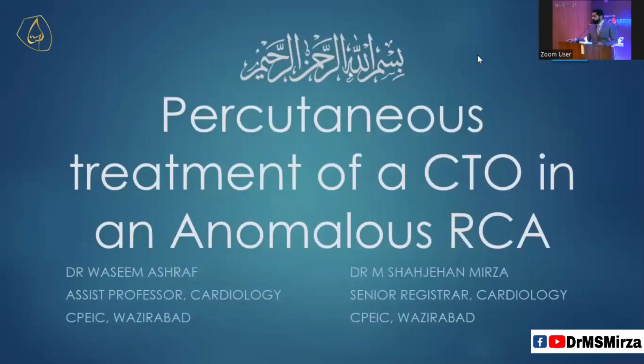I'm Dr. Mohammad Mirza, currently working as Senior Registrar in Chaudhry Pervez Institute of Cardiology. And Dr. Wasim Ashraf, who is Assistant Professor of Cardiology, will accompany me in this presentation, which is percutaneous treatment of a CTO in an anomalous RCA.